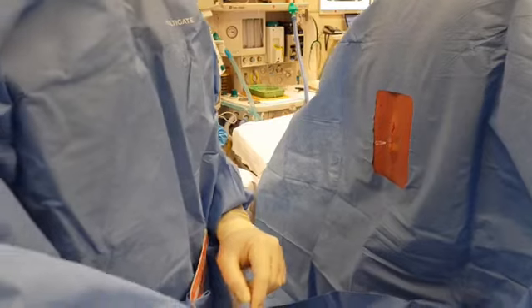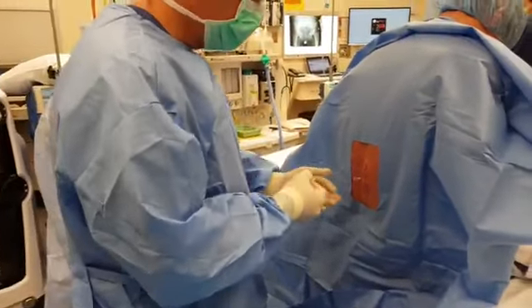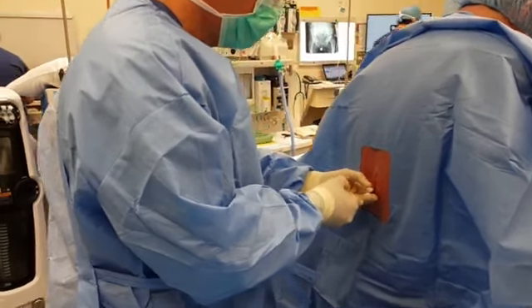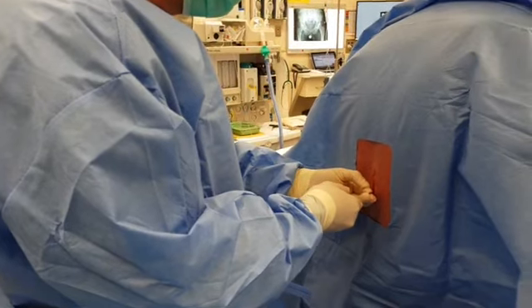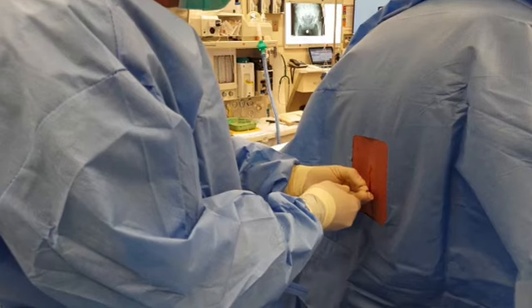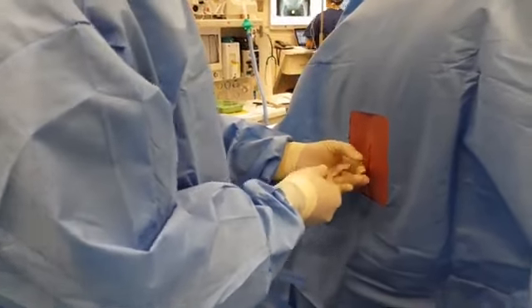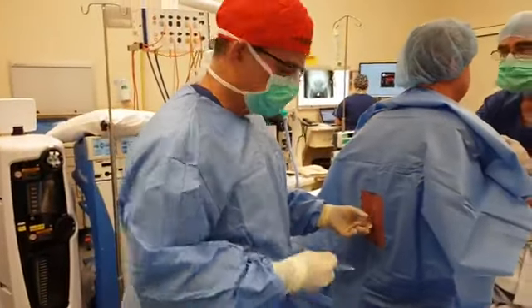That's the needle into the ligament. We've got a very good patient here who's cooperative. Just advancing a tiny needle forward. Doing really well. And that's all done. It literally takes 30 seconds to do.